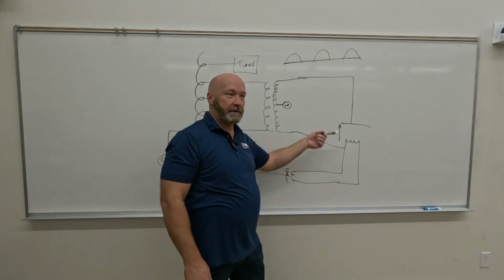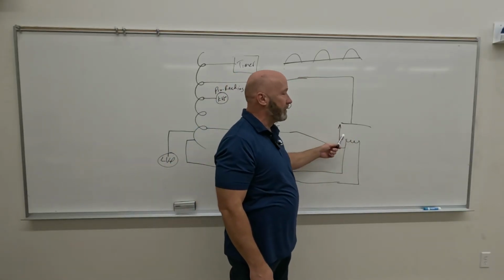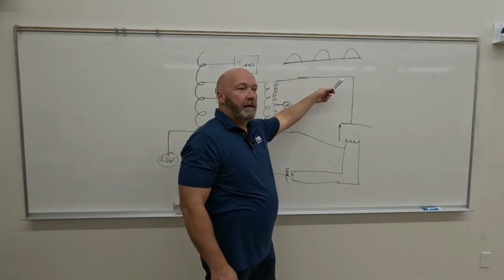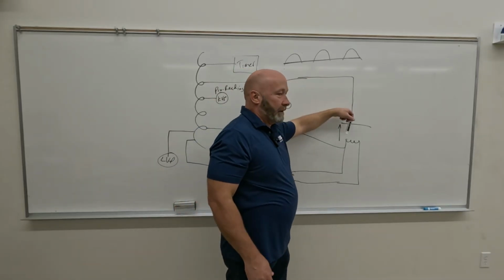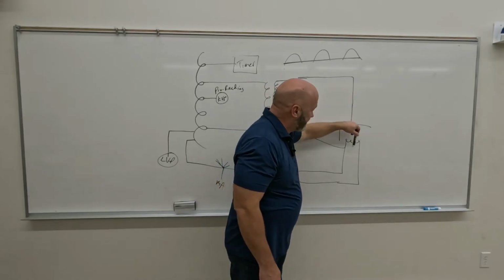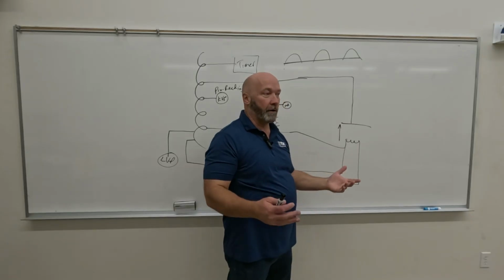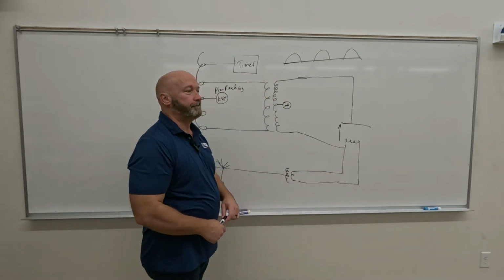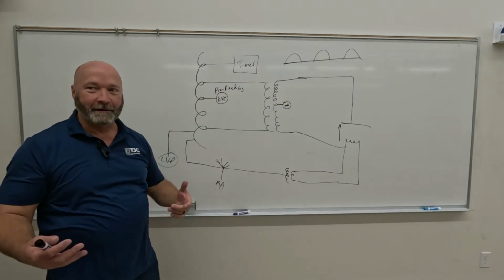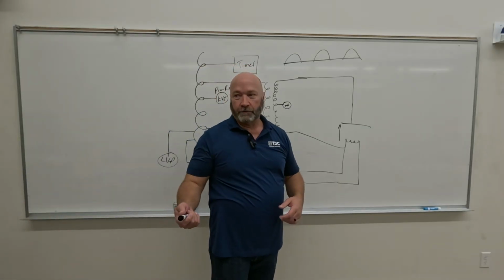If electricity goes from here to there, we're only using half of the wave. If it starts to come back this way, there is the possibility that we could get thermionic emission off of that and send the electrons back across the X-ray tube and break our filament. We have a problem, right? So we've got to rectify it. One of the few things in radiology that makes sense is that we're going to do that with rectifiers, okay?